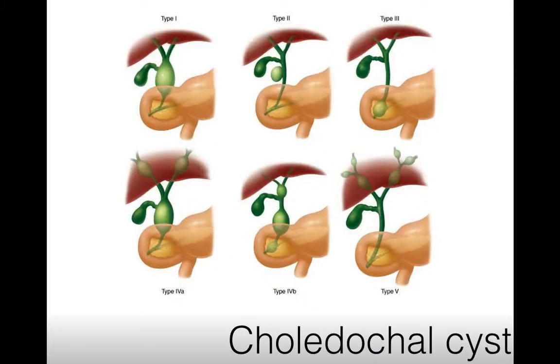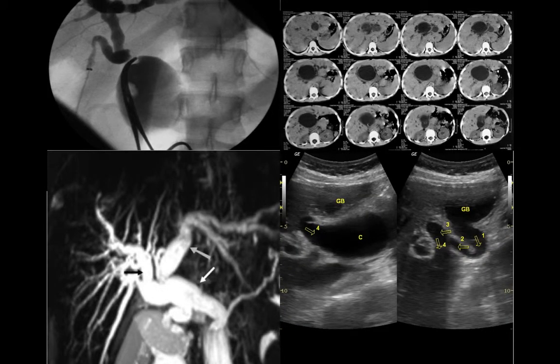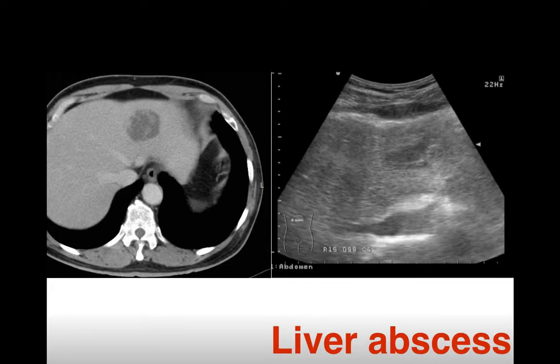This kind of situation may be encountered in pediatric patients: choledochal cyst. If you know the cyst, the duct should become smooth. In different situations, when you see abnormal dilatation, you should consider choledochal cyst in pediatric patients, just like this kind of image. This is the gallbladder and down the neck to the CBD. You can see abnormal dilatation. I have no typical and clear video of this kind of disease.